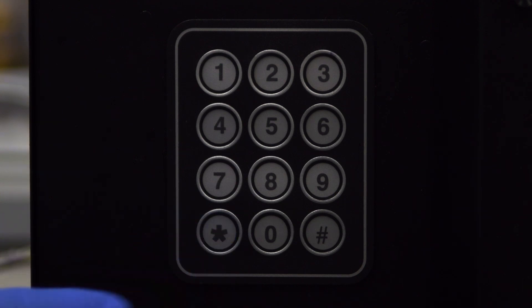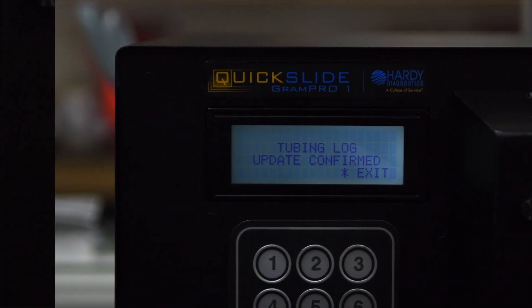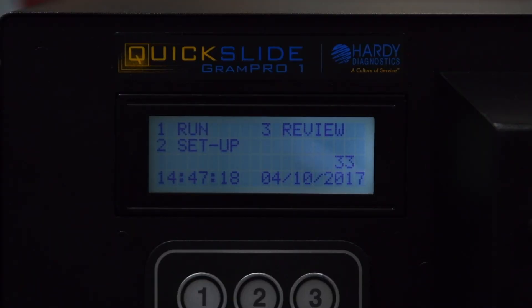Press the star key once. Press 1 to update the tubing log. Press the star key to return to the main menu.